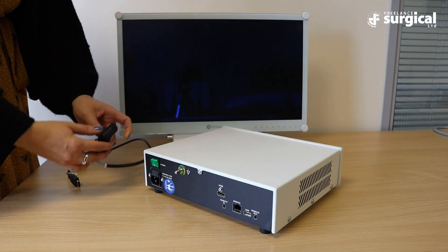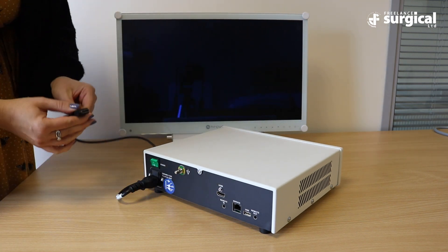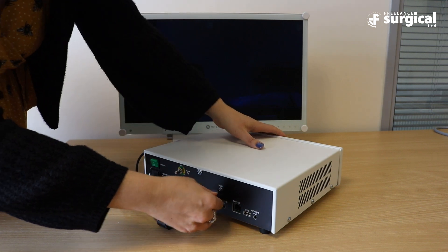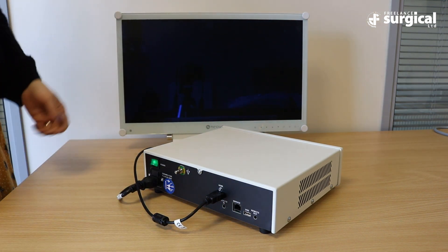To start, you need to plug the power cable into the light source. Now plug the HDMI cable from the monitor into the back of the light source. Once plugged in, turn on the unit.